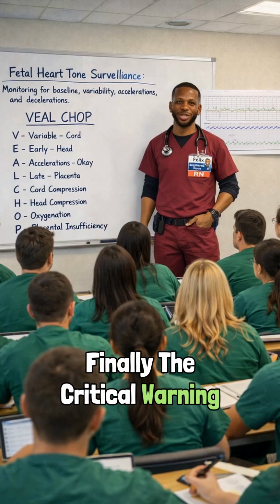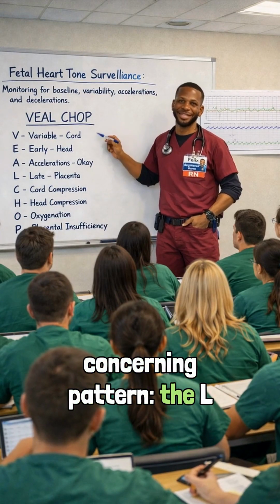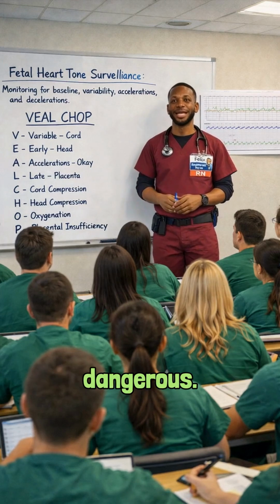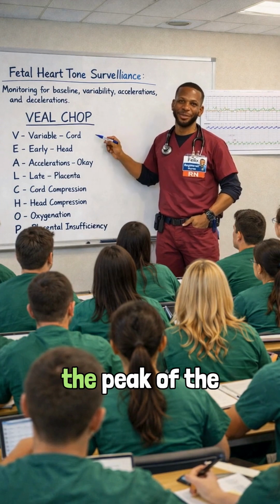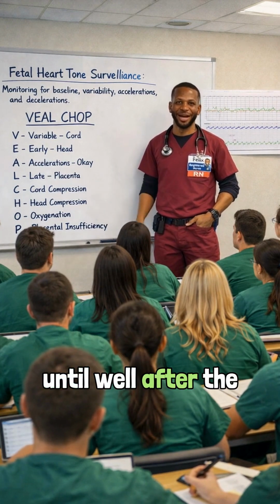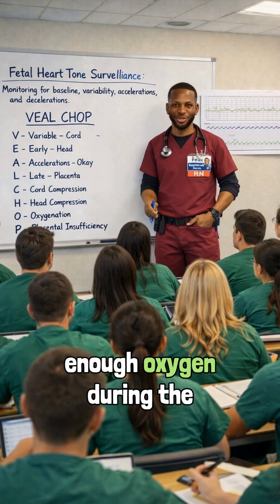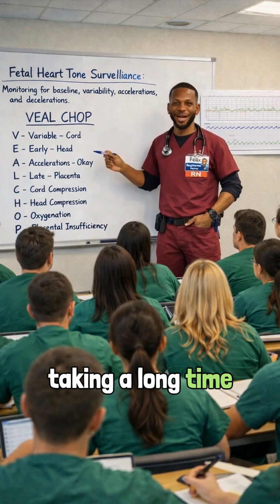Finally, the critical warning one is the late decelerations. This is the most concerning pattern, the L for late decelerations, which is linked to the P for placental insufficiency. These are subtle and dangerous. Unlike an early deceleration, a late starts after the peak of the contraction and does not return to the baseline until well after the contraction has finished. This timing gap tells us that the placenta is struggling to provide enough oxygen during the peak of the contraction and the baby is taking a long time to recover.